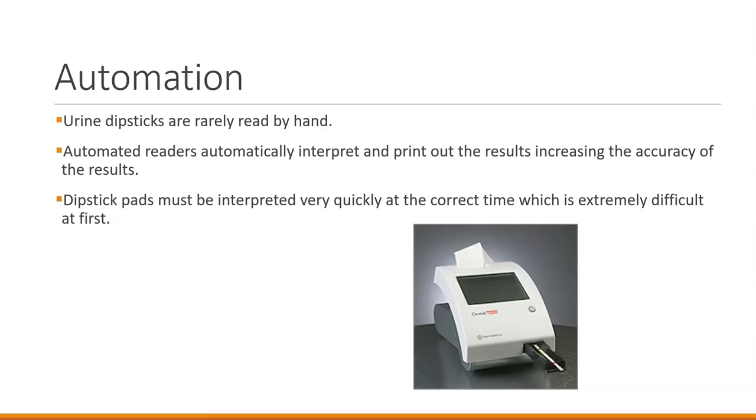One of the most difficult pads to read is protein, and you have to read it under really good light. And keep in mind, if you call something abnormally positive, then that reflexes to additional tests. Those additional tests cost money, so you always want to be very, very careful. So sometimes if I'm unsure of the interpretation of a certain pad, I will borrow somebody else's eyes.